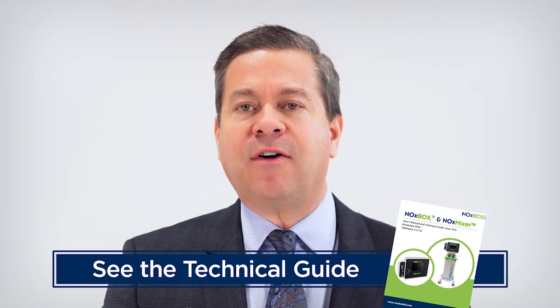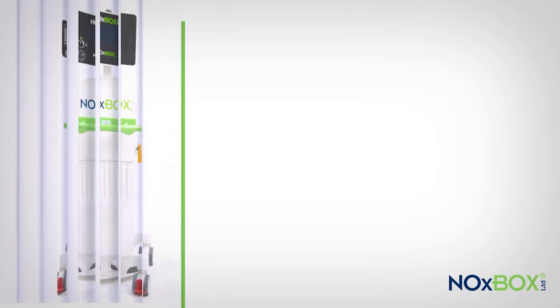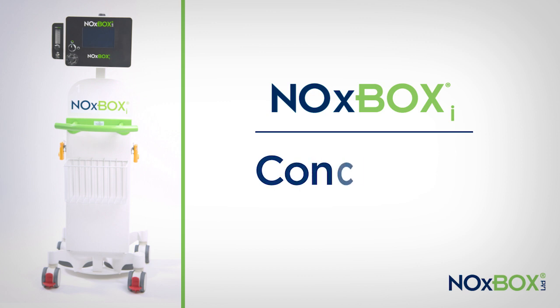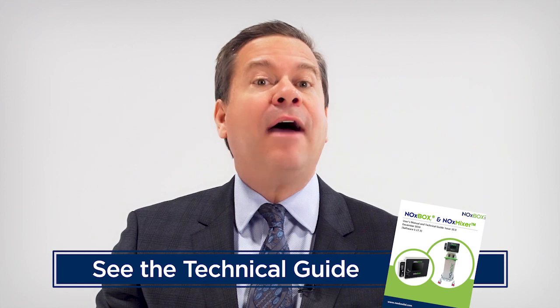Before using the NOxBOXi system, please read and understand all safety precautions as outlined in the technical guide. For additional safety and cautionary statements, refer to the cylinder gas instruction manuals and safety data sheets. That concludes our video training for the NOxBOXi delivery system. Please refer to the technical guide for more detailed information on how to safely set up and use the device.